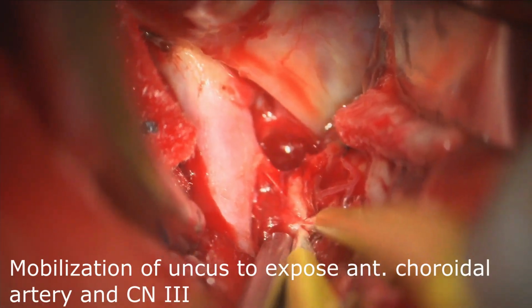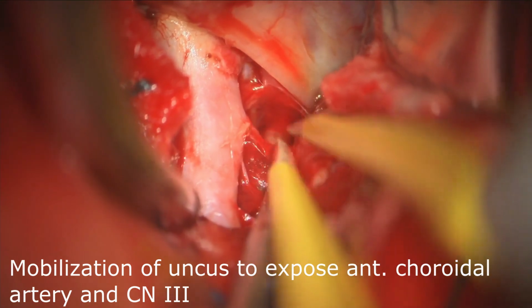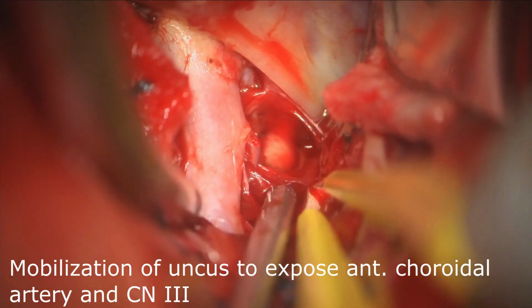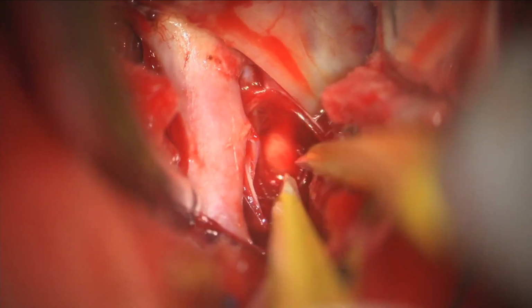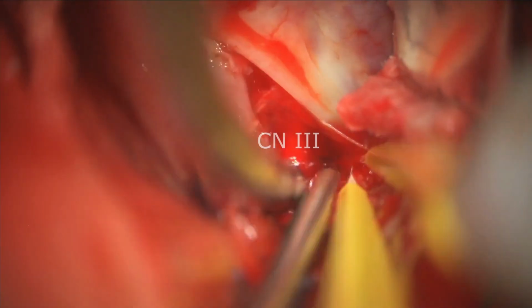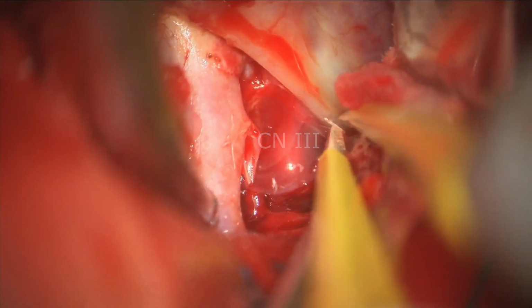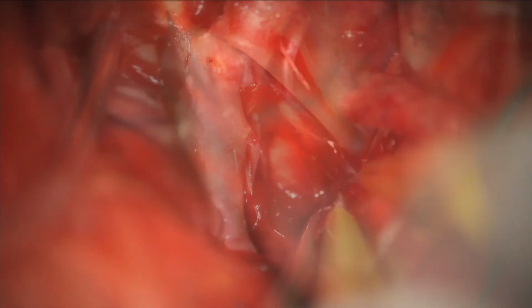And a key part of this approach is also mobilizing the uncus off the lateral aspect of the carotid artery. Here we're peeling the uncus back off the internal carotid artery, and here we start to see the third cranial nerve, which enters into the oculomotor foramen. And we're working here along the tentorial edge, widening this space.